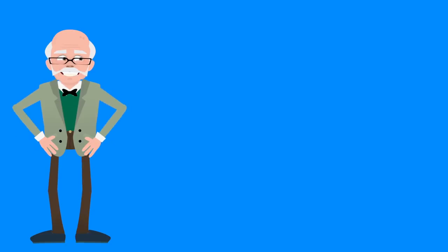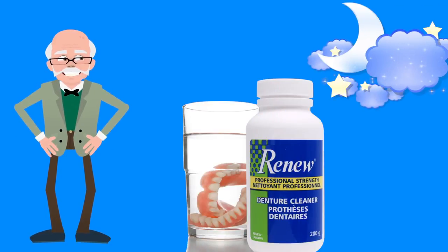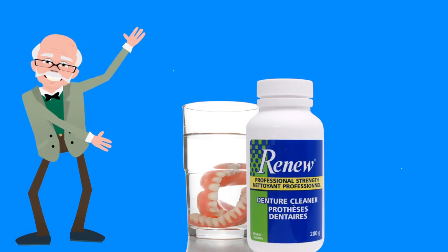If your dentures are particularly stained, soak them in Renew overnight. You'll be amazed to find them looking brand new all over again.